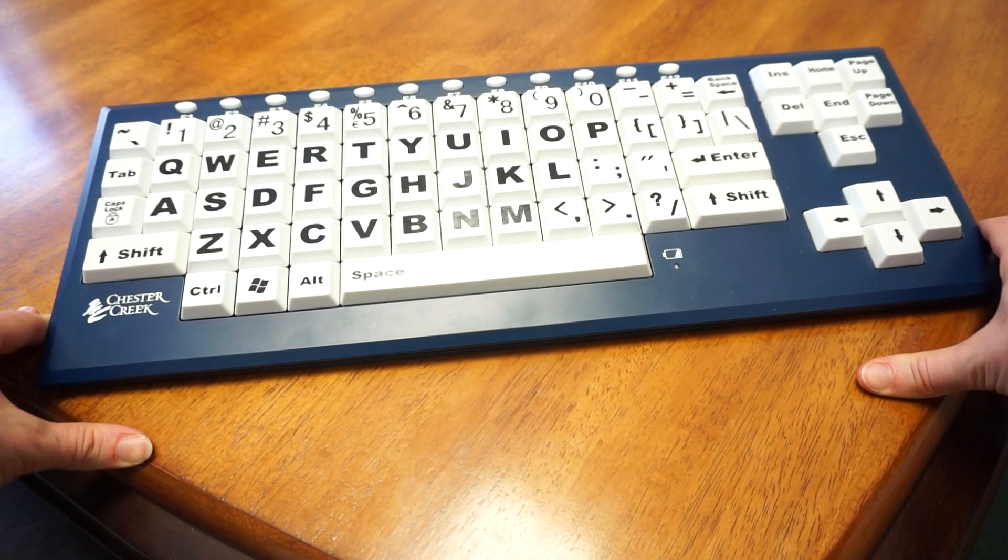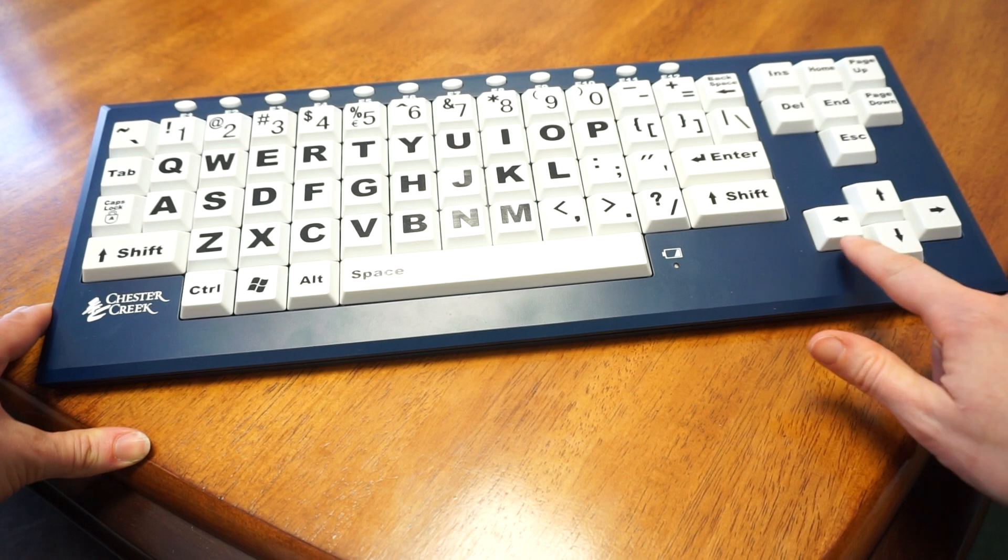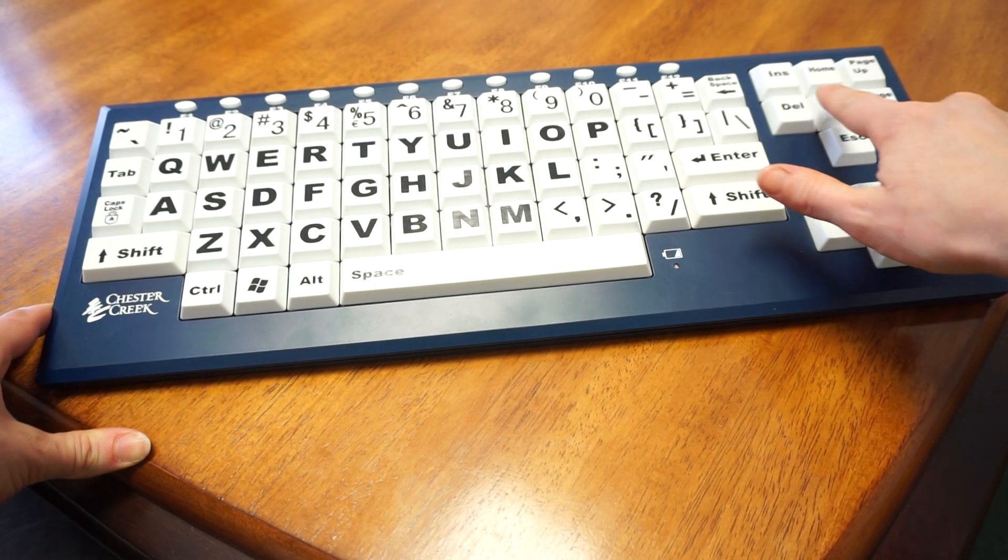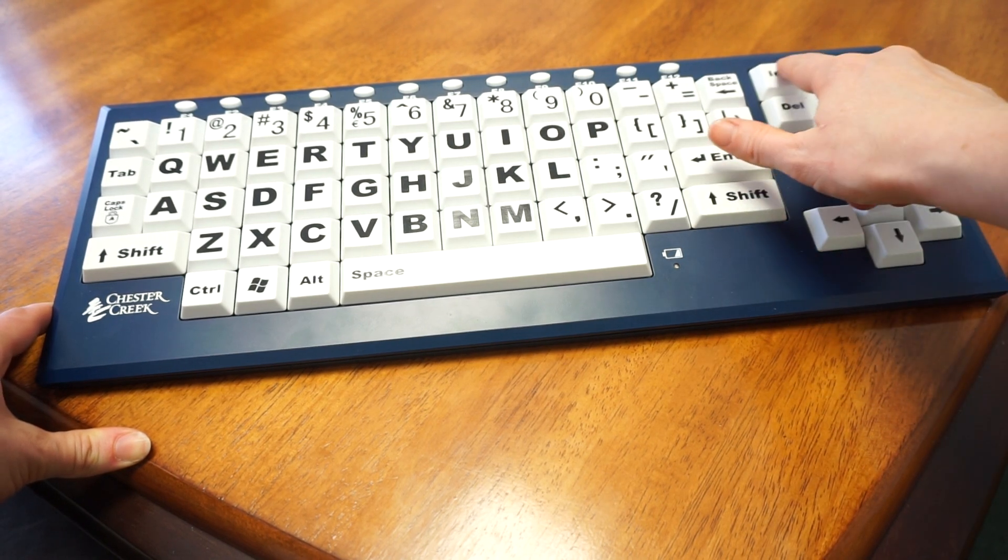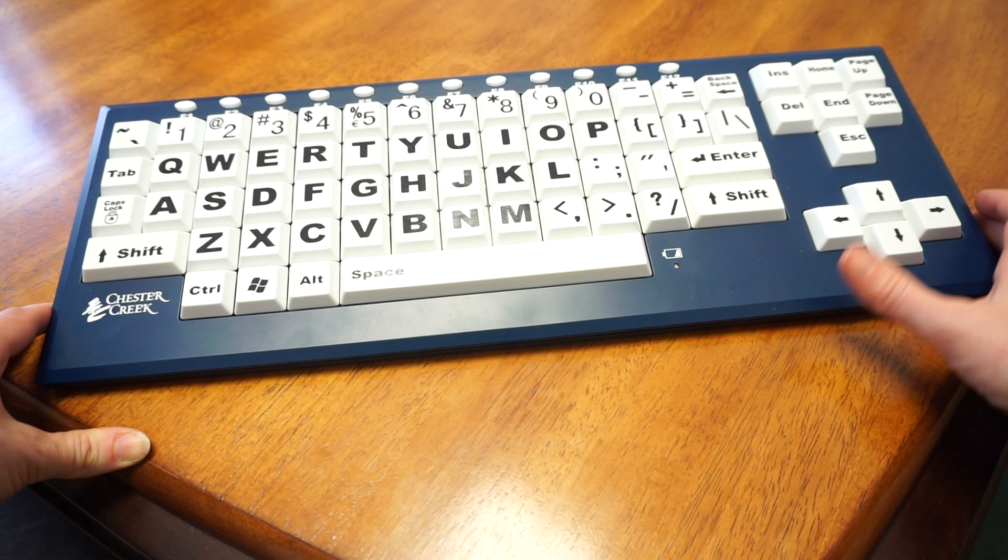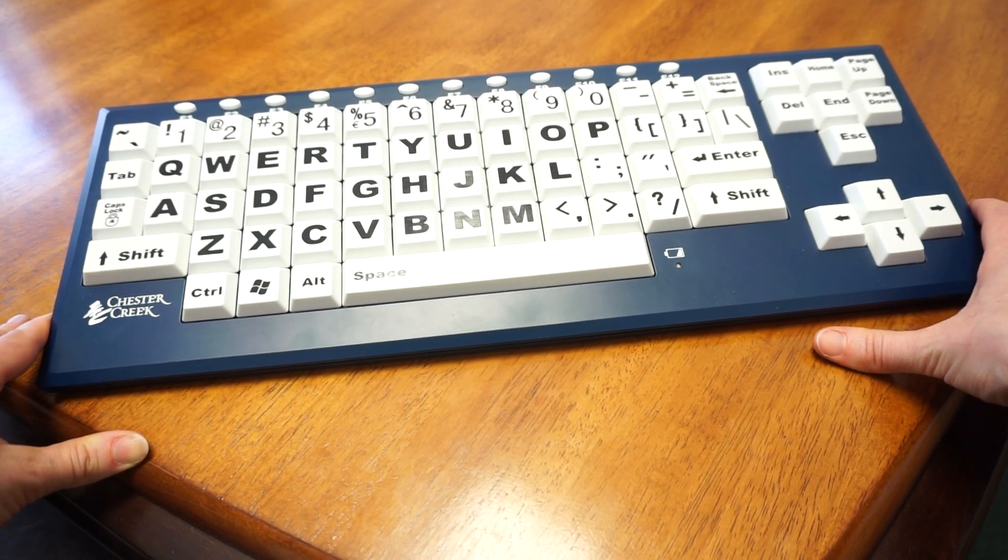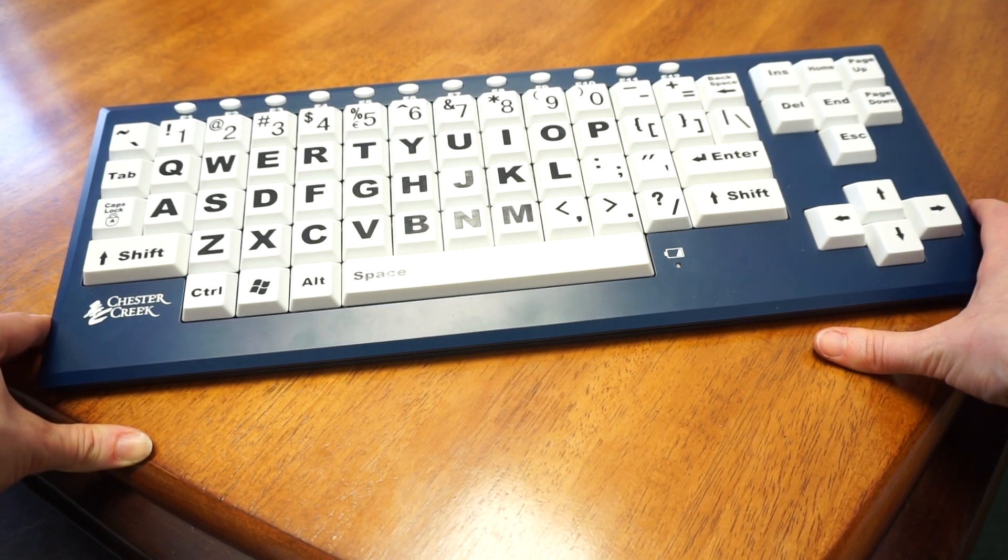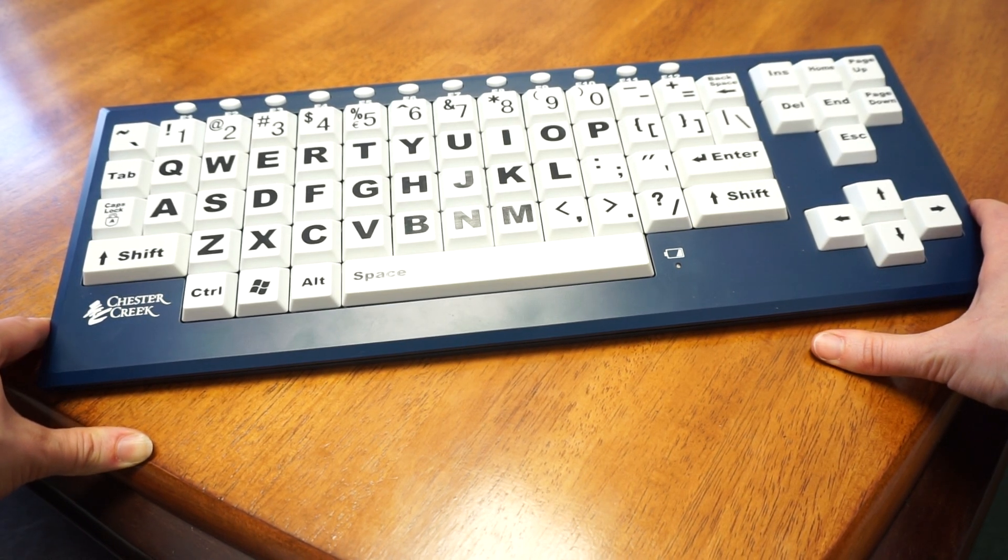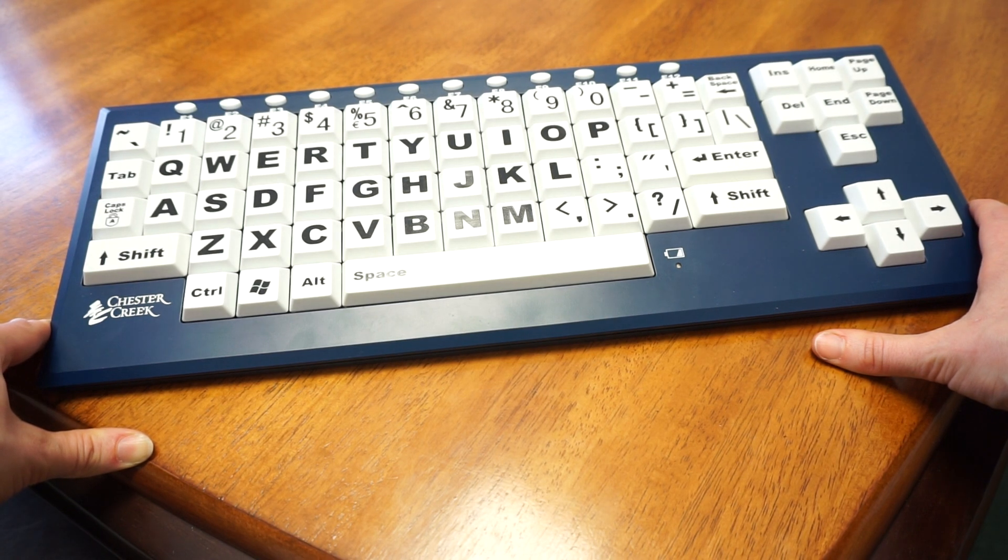It's been slightly simplified. You can see over here we have large arrow buttons, insert, home, delete, end, etc. There are fewer buttons than on a typical keyboard but enough to operate the entire computer.